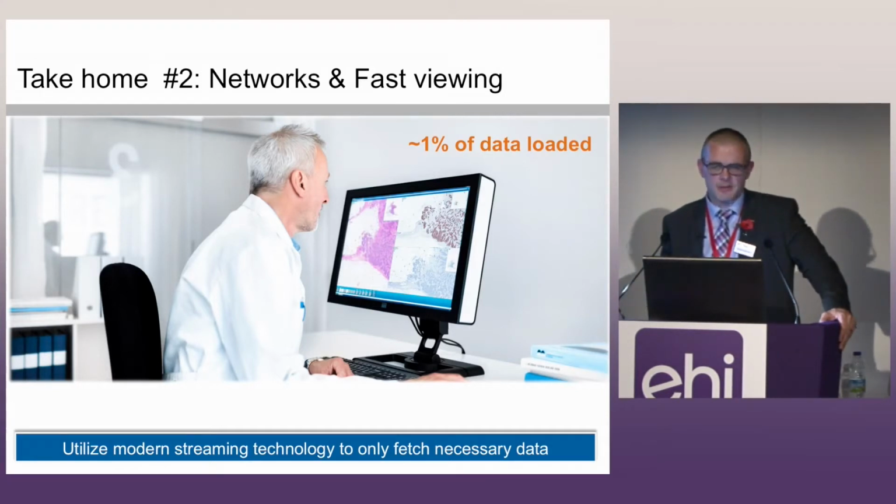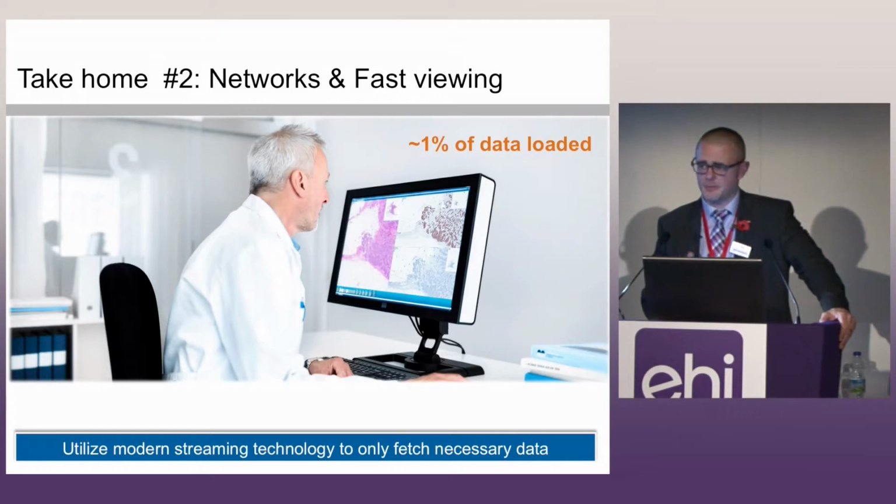Today we're able to leverage modern streaming technologies such that the 50 gigabyte file will go from the scanner to the archive, but when viewing that slide, the pathologist only needs to look at about 1% of that slide in terms of the data footprint. Okay, you can't do that unless you're leveraging the streaming technologies.